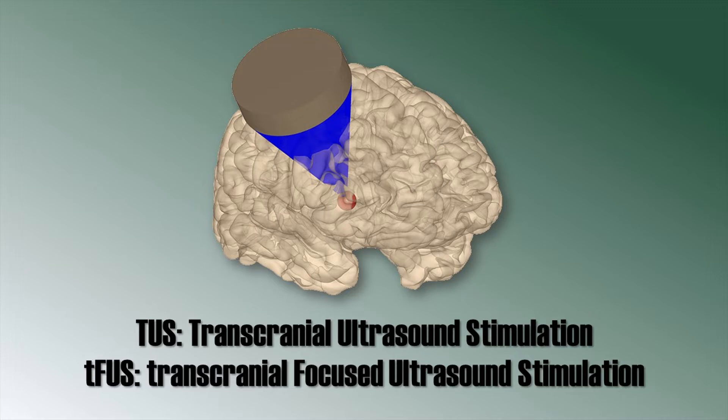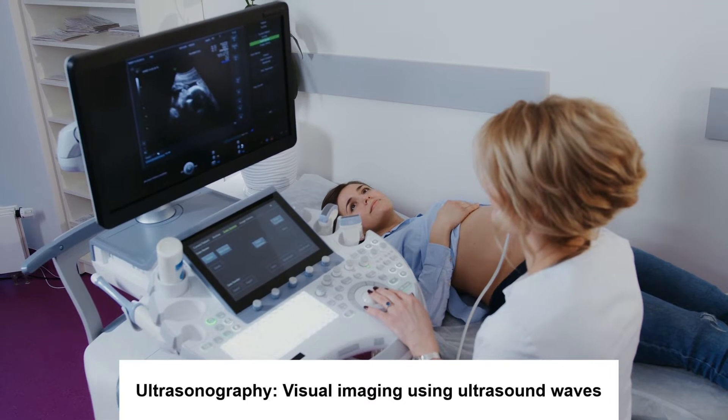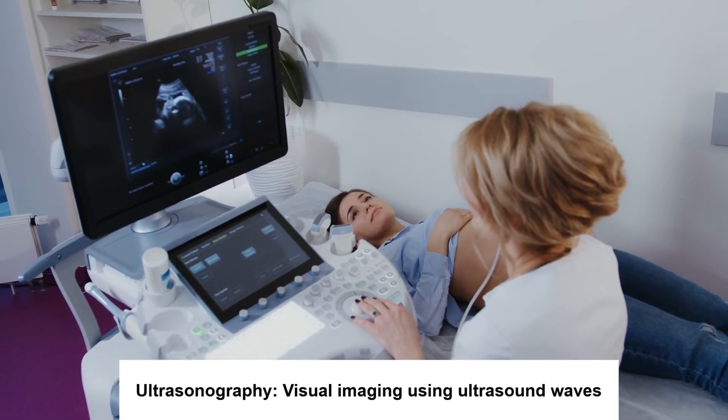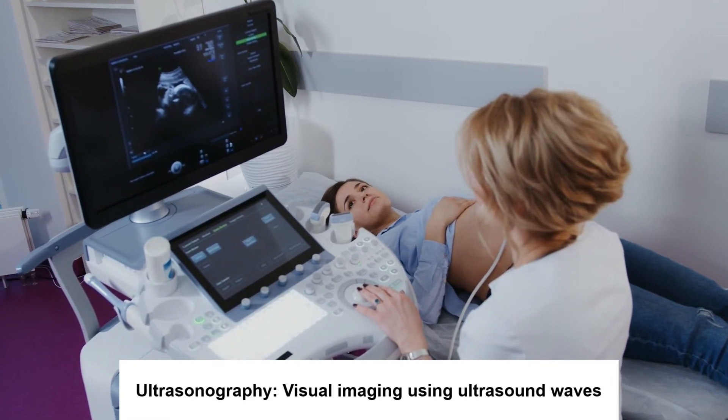Most people will have heard about ultrasound sonographs that are used for looking inside the body, for example when looking at a developing baby in a mother's womb. But ultrasound waves can also be used in much different ways.